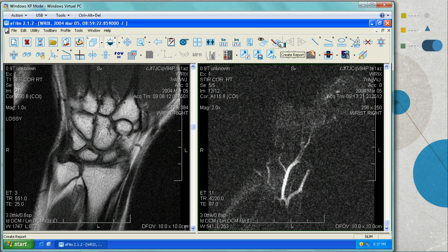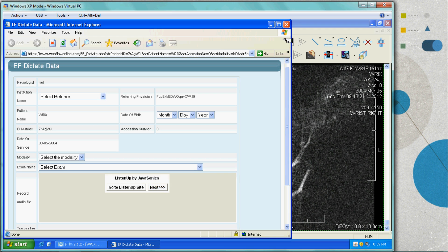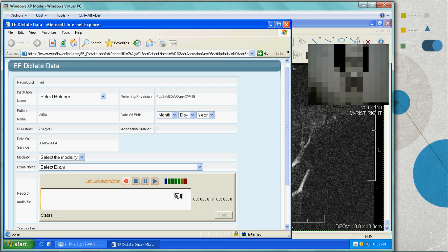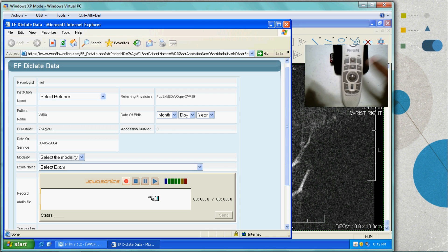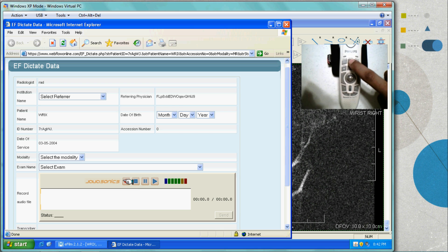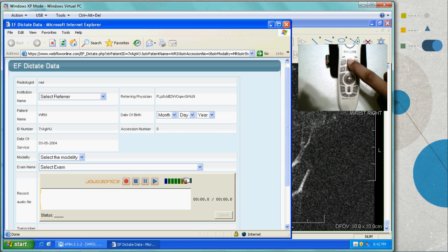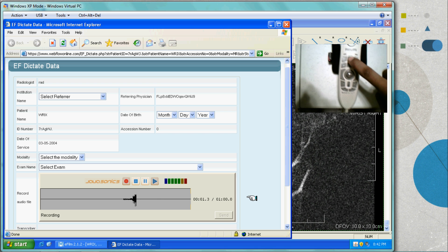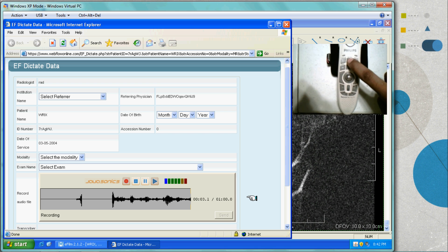Here they would click this icon — Create Report. Now we have our webpage which opens up a direct connection to Webflow Online. All the patient demographic information is pre-populated.